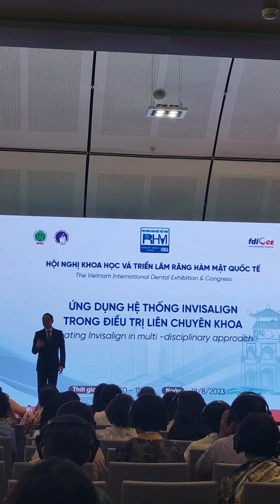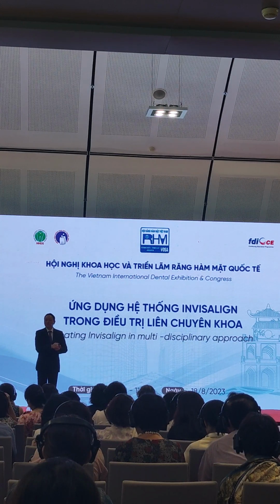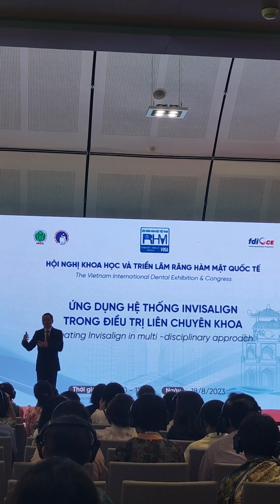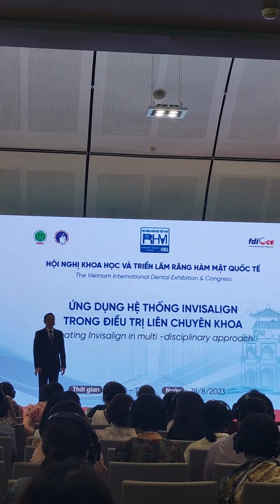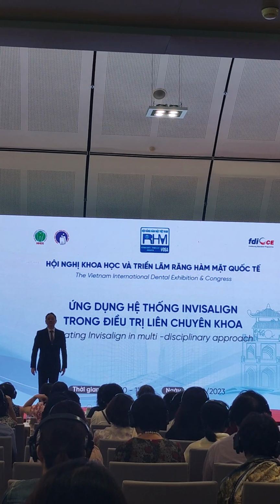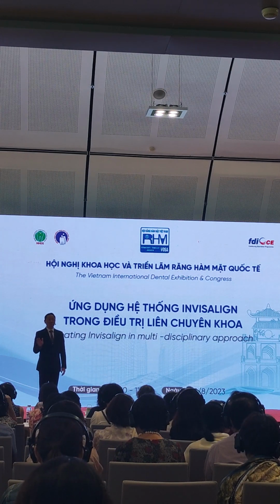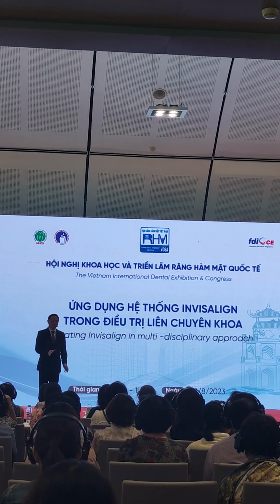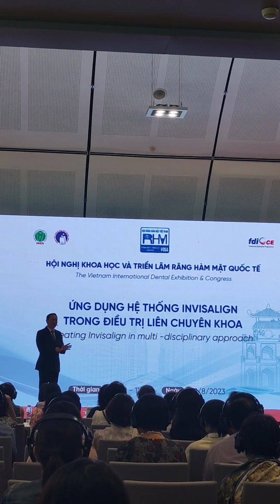So I accept the transition stage where we get premature contact. But the most important thing is we manage it in the following stages. Just in case the patient gets this premature contact or overlap and has some mobility, or someone really has signs of traumatic occlusion, what I do is stop treatment, check the status of the tooth, do a ClinCheck, check the CBCT if needed, and then manage.